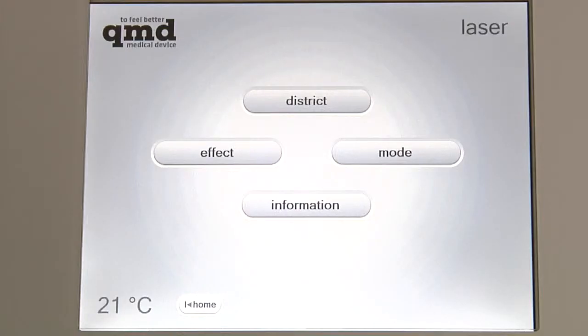As regards the underlying chronic tendinopathy, we aim for a biostimulant effect. About the patient's symptoms, contrariwise, we will have an analgesic effect and a relaxing effect on the whole musculature of the dorsal side of the forearm.